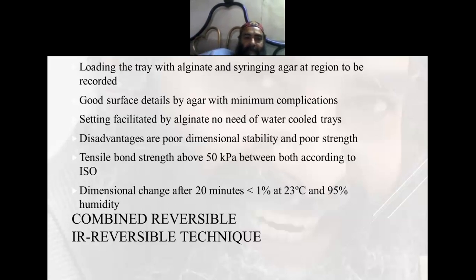Load the tray with alginate and syringe agar to the region to be recorded, as agar can take impressions of surface details with minimum complications.